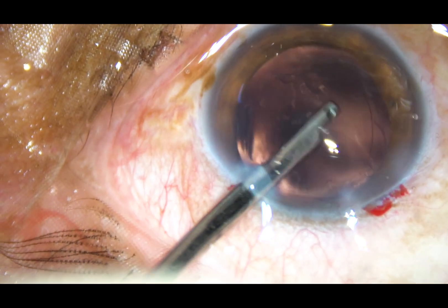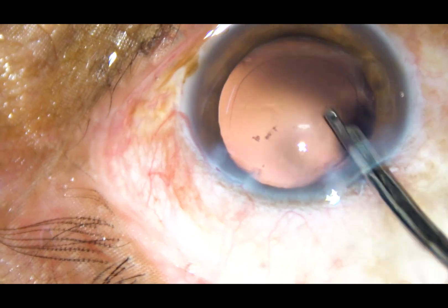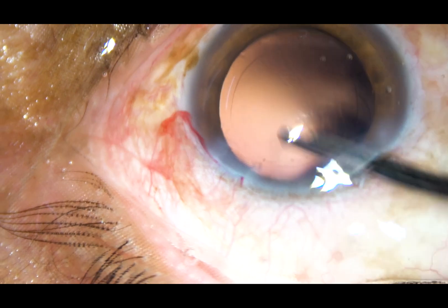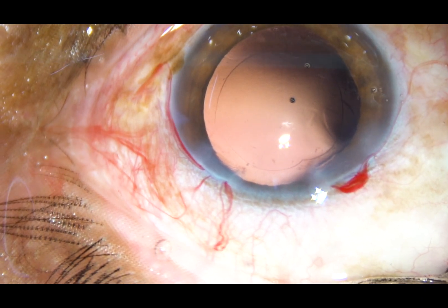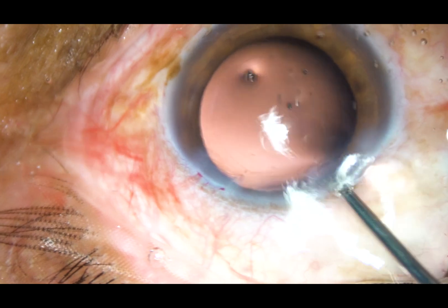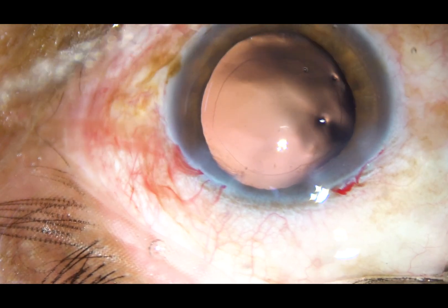Now the cortex from the upper part is removed. Some lens matter that sticks to the posterior capsule is polished out. A foldable intraocular lens has been selected for this case, and this is a little bit of polishing of the posterior capsule.